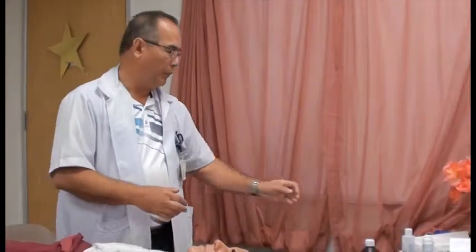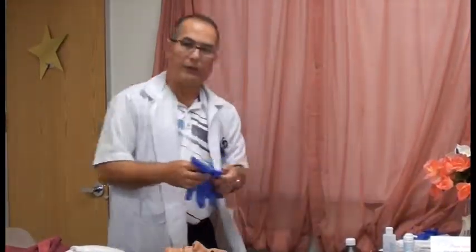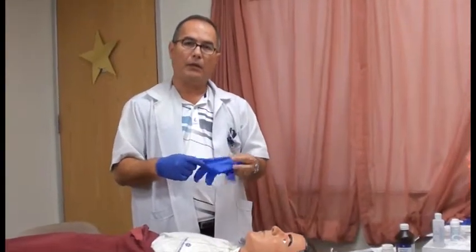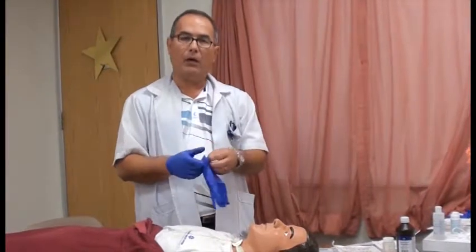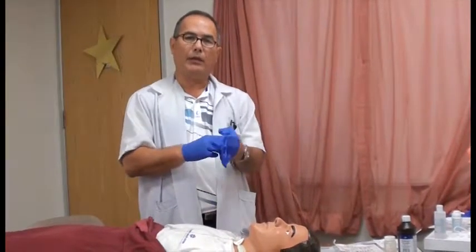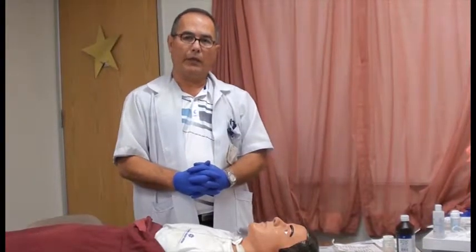So the first thing we're going to do is make sure we wash our hands and don our gloves, and introduce ourselves to the patient as far as what we're going to be doing and what to expect from our procedure. It should not cause any pain or discomfort to the patient while we're doing this. And again, we should be demonstrating the technique of tracheostomy care to the patient and the family.